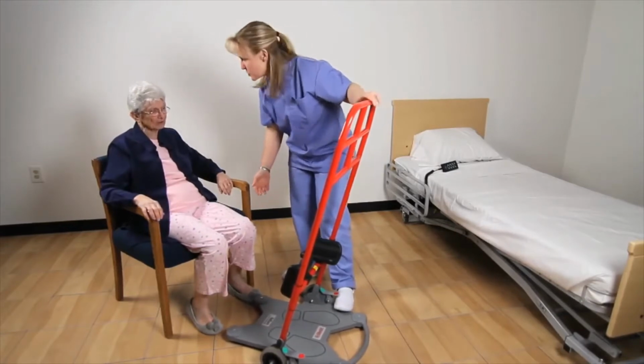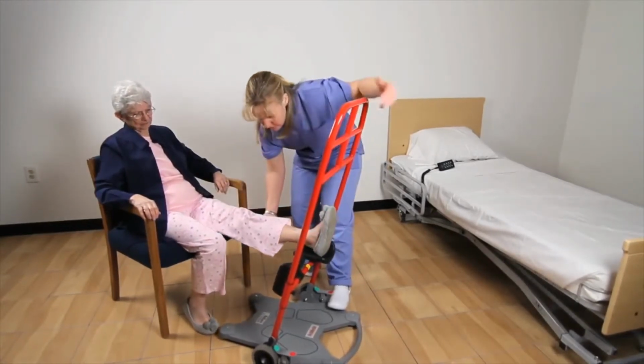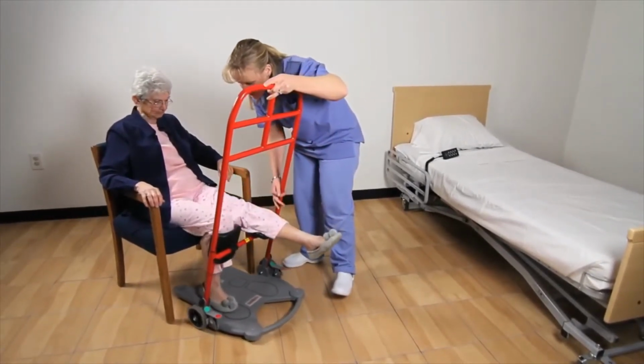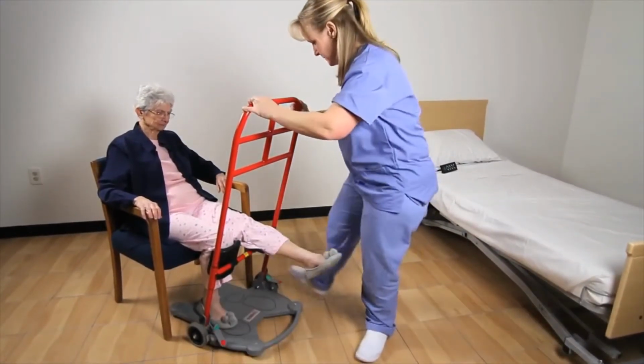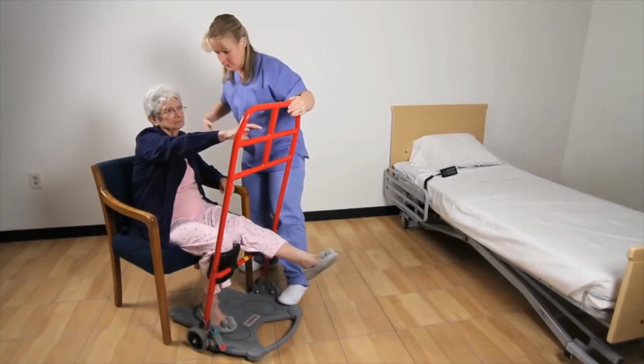necessary shin support over. When pulling the Return up to the patient for use, extend the leg that cannot bear weight and help guide the back of their calf onto the rotated shin support to rest. Once the Return is in the proper place, adjust the height of the shin supports up just below the kneecap of the leg that can bear weight.